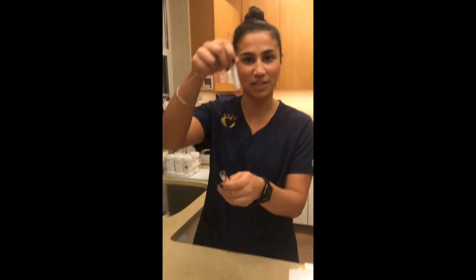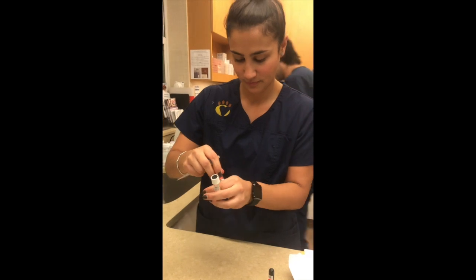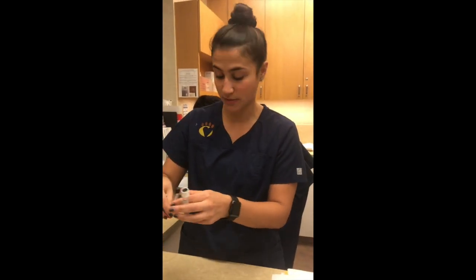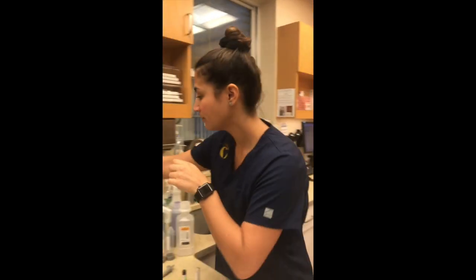And there's our recipient serum. And now we will move on to the next step, which is spinning down our EDTA tubes. Okay, so now we're going to centrifuge our EDTA tubes.